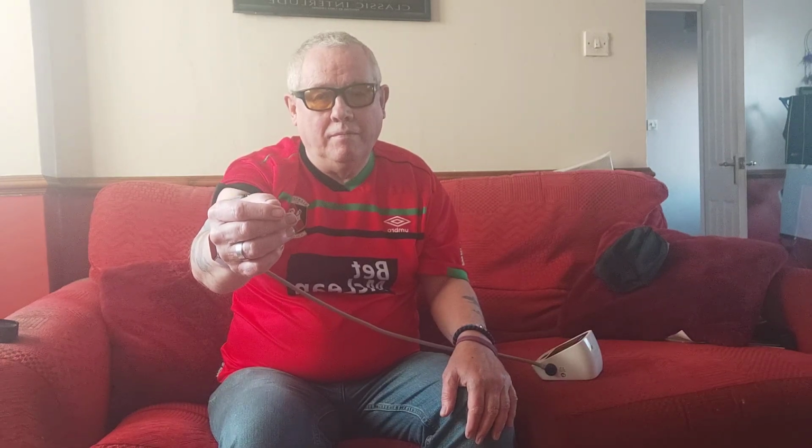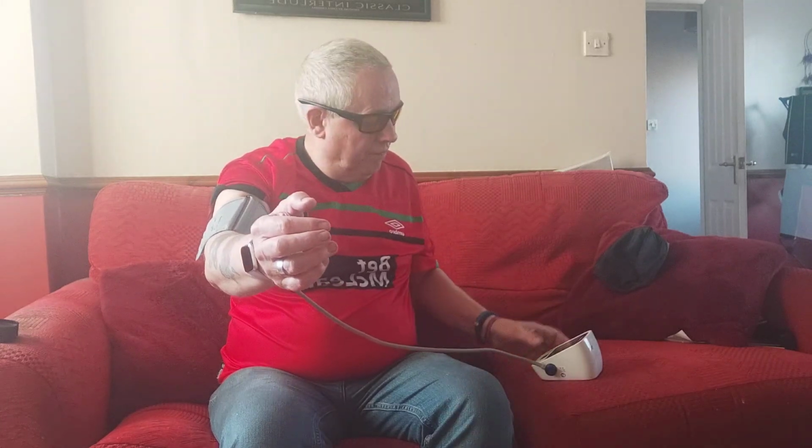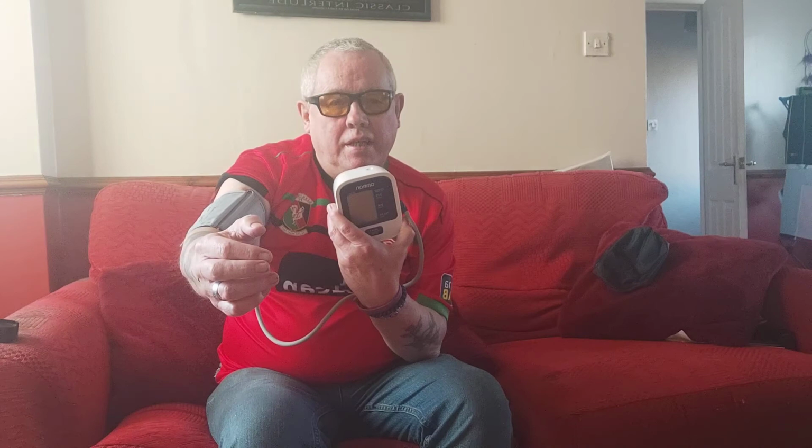Now, I'm a big Google fan. I'm sure a lot of you know that if you've watched my videos. And I found to get a more accurate blood pressure reading, you hold your hand up like that, level with your heart. So that's the way I'm going to do it right now. So that's my arm level. I've got my machine here.